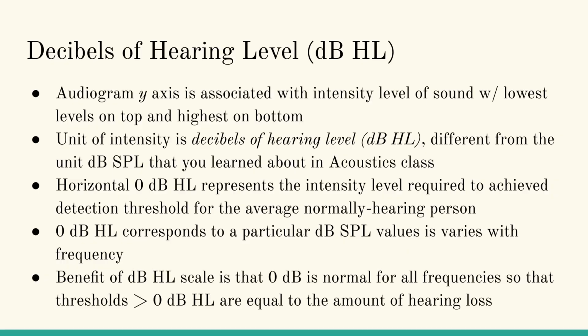The benefit of the dBHL scale is that 0 dB is normal for all frequencies, so that thresholds greater than 0 dBHL are equal to that amount of hearing loss in dB.